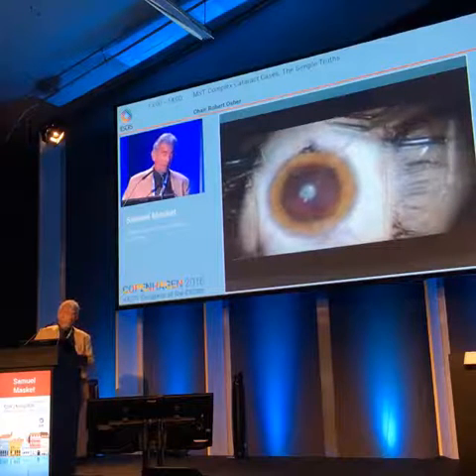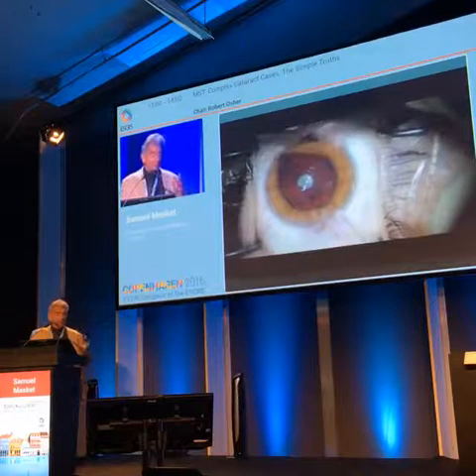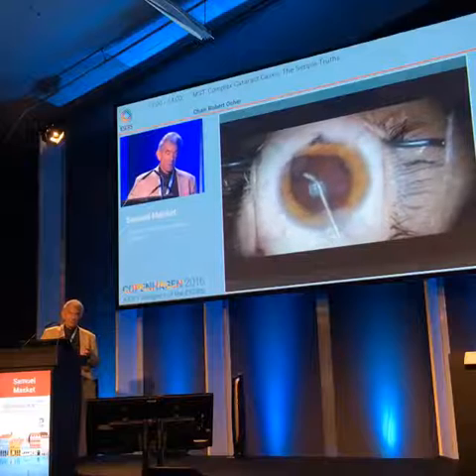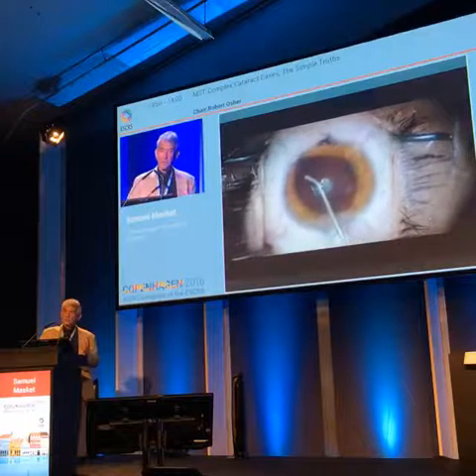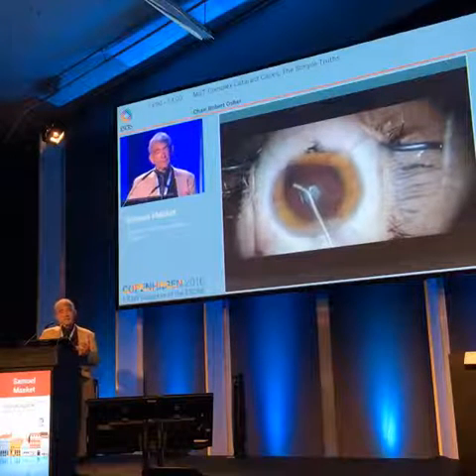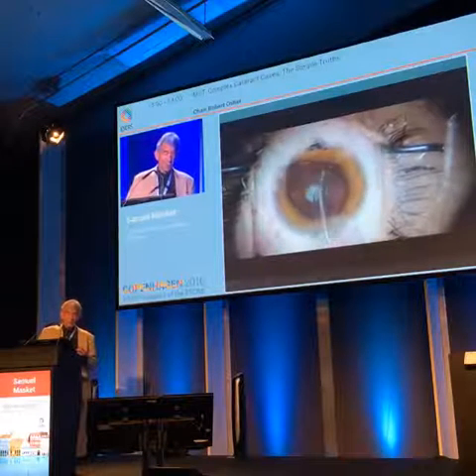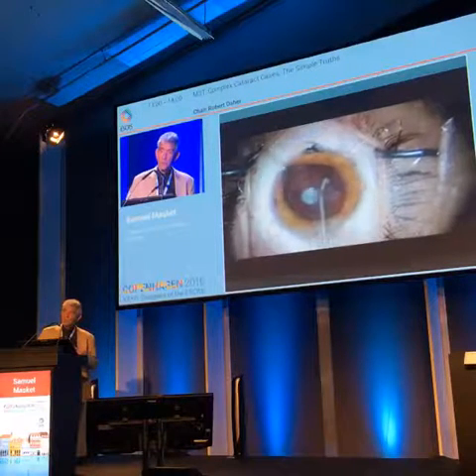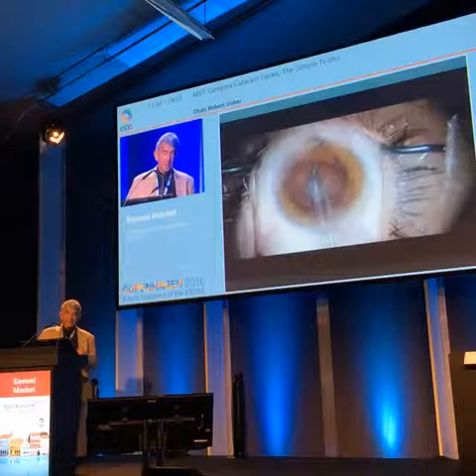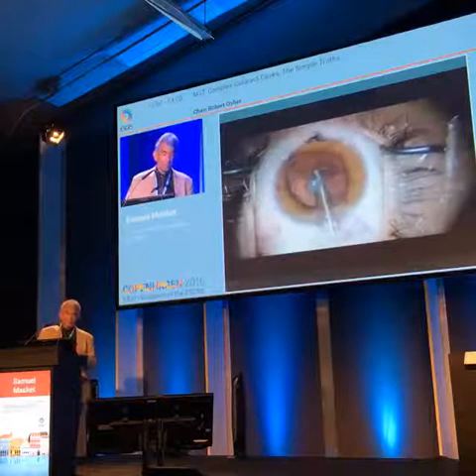Again, this is a post-femtosecond laser patient. Now, as Bob just mentioned and teed up perfectly for me, once you've already done a significant amount of surgery in the chamber, it's extremely difficult to avoid the capsule if you want to put in the ring. If you've used a stain, it makes it a lot easier, but you can't stain at this point. So, to me, the use of hooks in this situation is safer as a secondary thing, so I tend not to use the ring once I've already done a significant amount of nuclear cortical removal.